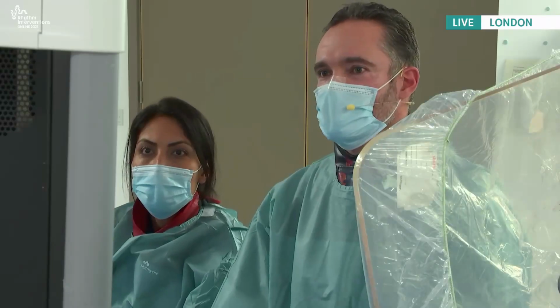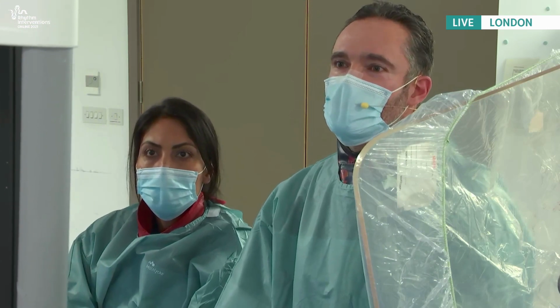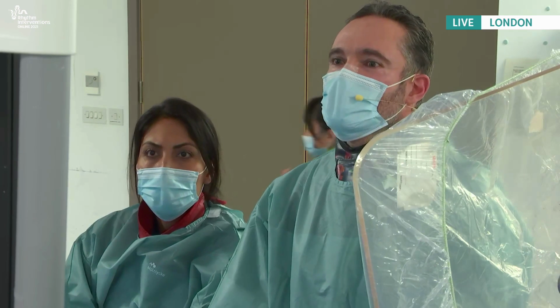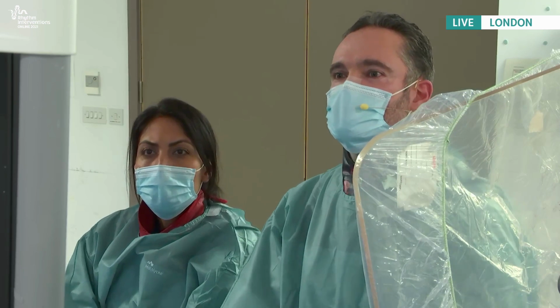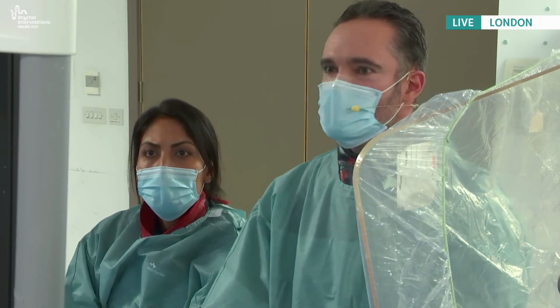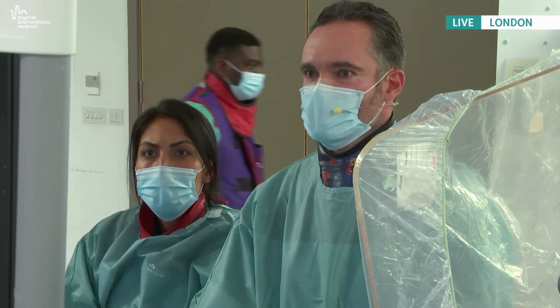So we've got a 70-year-old gentleman with persistent AF for about 15 months. He's failed a previous cardioversion, and he's been back in persistent AF for about 6 months following that. He's not tolerated beta blockers and is just on some calcium channel blockers and anticoagulation. Got a previous history of coronary disease, but with normal left ventricle. He's got a moderately dilated left atrium, but otherwise a fairly normal heart structurally.